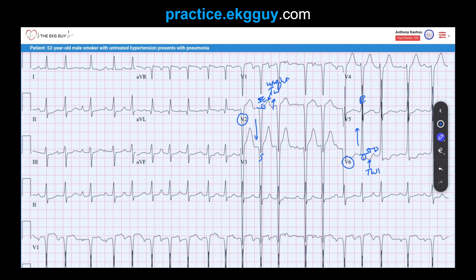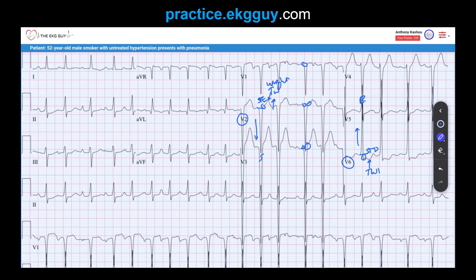The fourth tip: LVH can create a pseudo-infarct pattern. The QS complexes and poor R-wave progression in V1 to V3, combined with ST elevation and upright T-waves from repolarization abnormalities, could lead you to diagnose an anteroseptal MI. However, in this case, those findings most likely result from the hypertrophied left ventricle, not an acute infarction. Clinical context is most important.